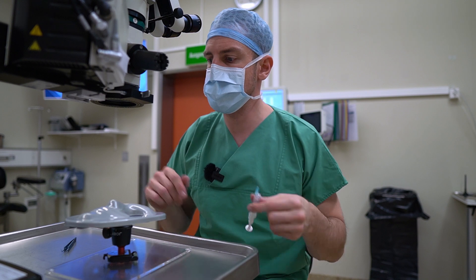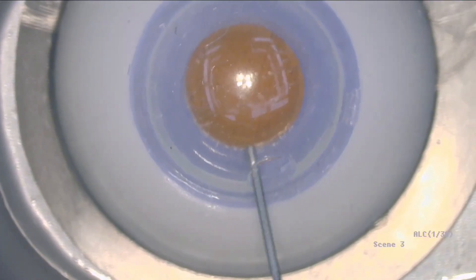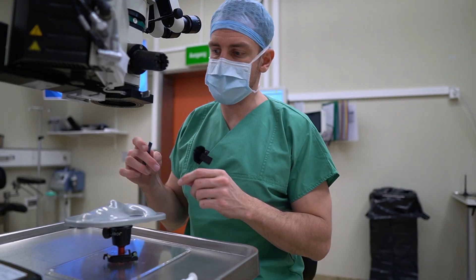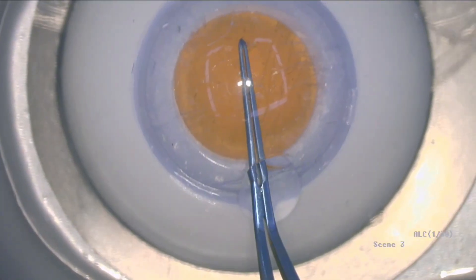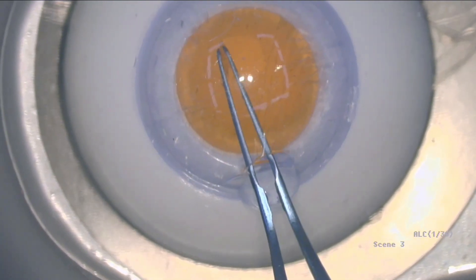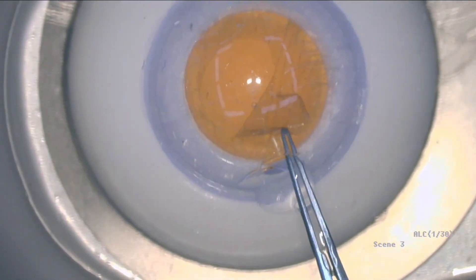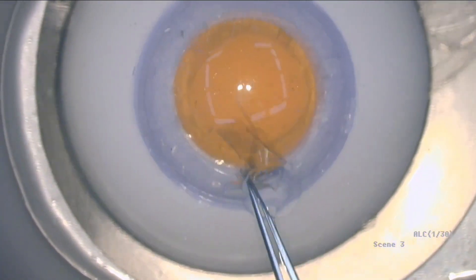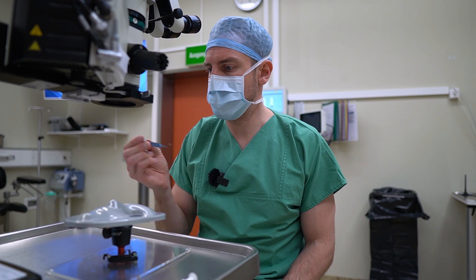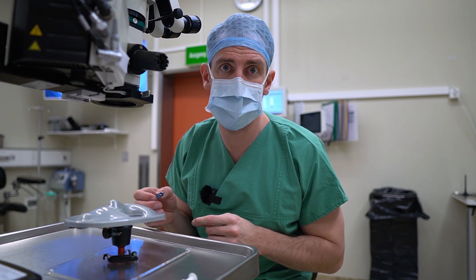Now let's put in some viscoelastic into that eye and see how the visibility is afterwards and if the capsule reacts differently. Looks pretty good like this. Go in with the forceps — oh yeah, that feels much better. It looks much better, feels much better. That was much, much better than using it with air. I'm going to do a couple more and then I'm going to get back to you with my thoughts and results.